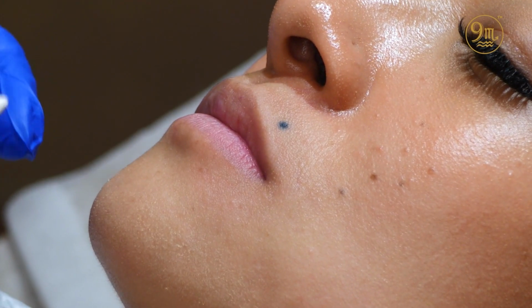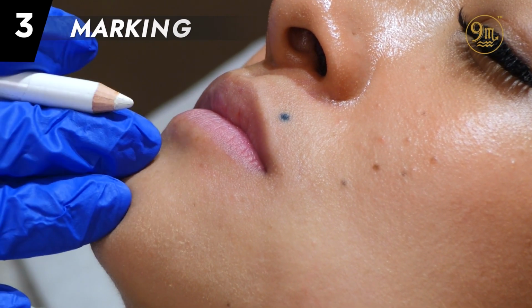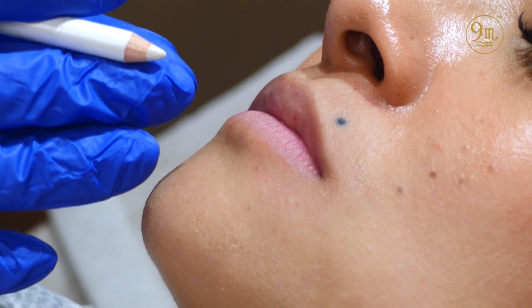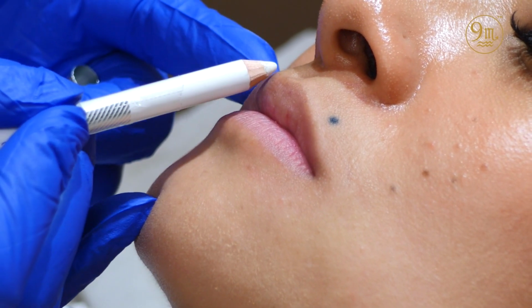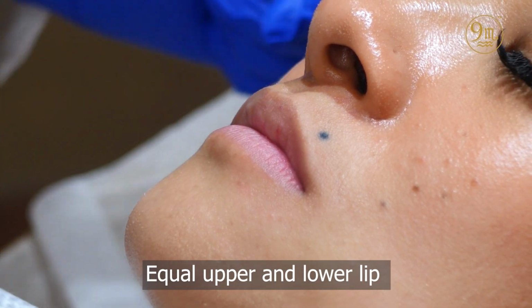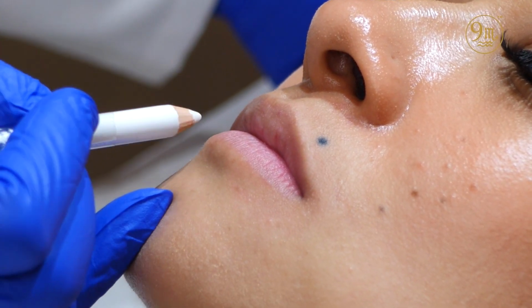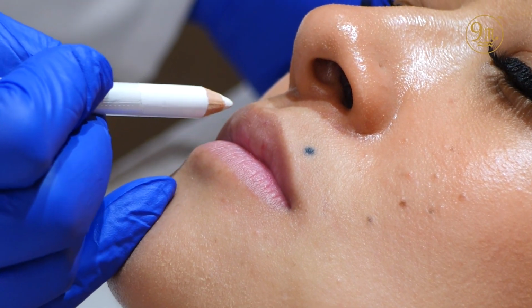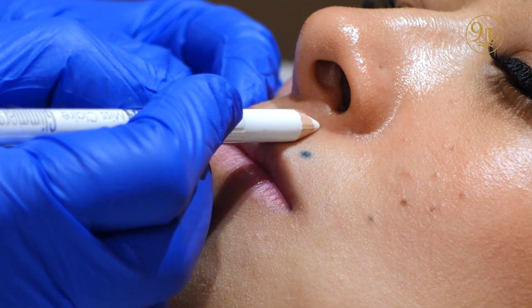Every lip is different and unique. For her lip, we are designing a treatment as per her lip anatomy. She has got equal upper and lower lip, which is, I think, quite fantastic. Her cupid bow and the mid zone of the lip is also good.